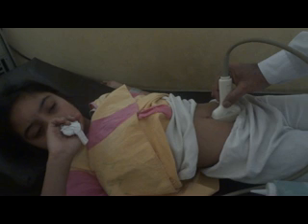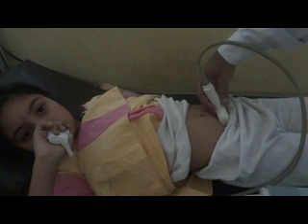Always see where the urinary bladder is. I am not getting the urinary bladder when the probe is straight in the suprapubic region. When I angle the probe towards the foot of the patient, quite enough, then I get this view. This is the urinary bladder — it is almost empty. These are the bubbles. The urinary bladder is almost empty.